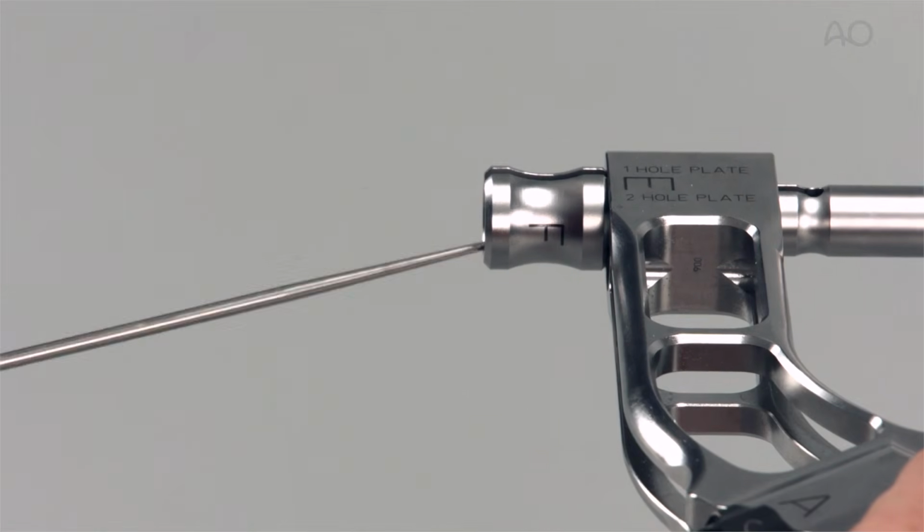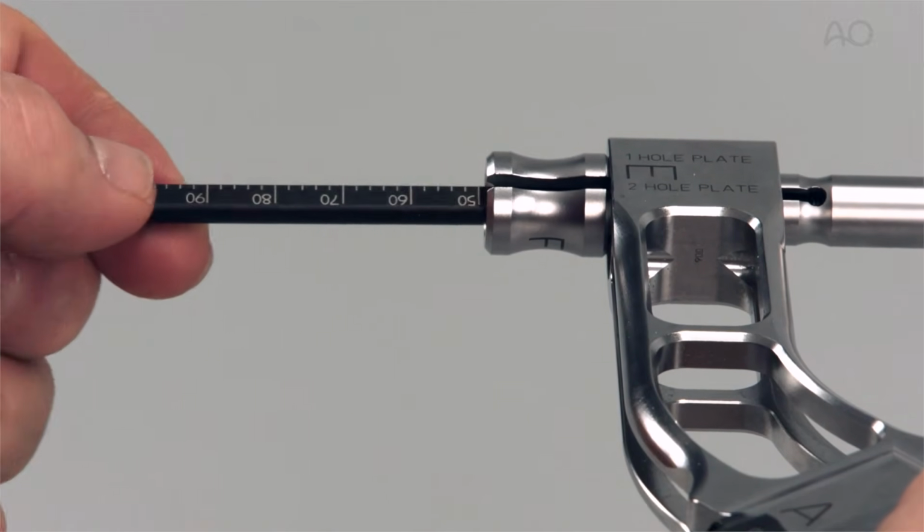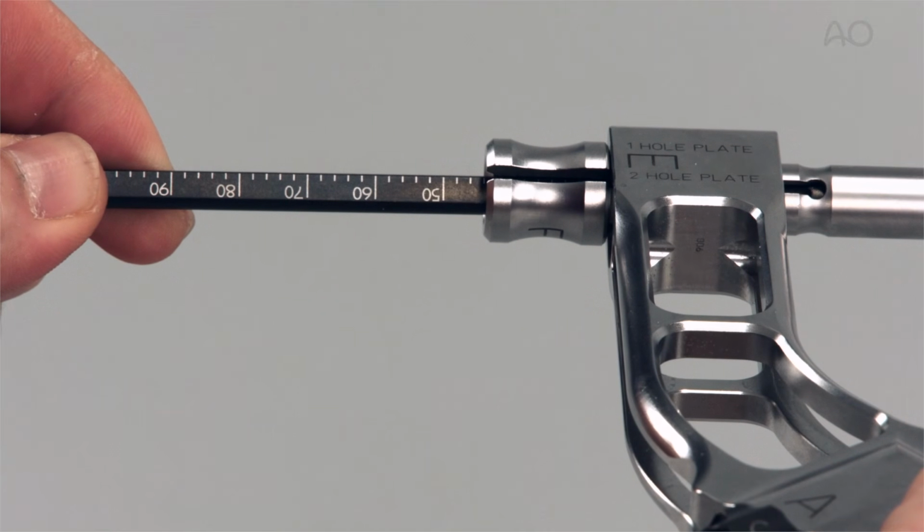Alternatively, the depth gauge can be used to measure the bicortical screw hole. Note that the screw length should be chosen at least 4 mm longer than the measured depth of the hole.